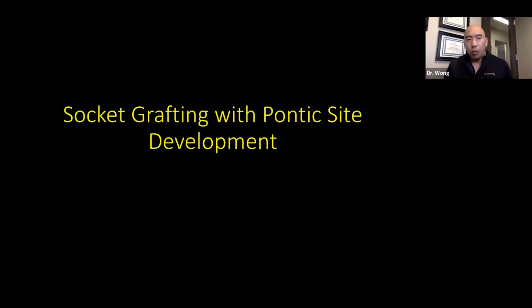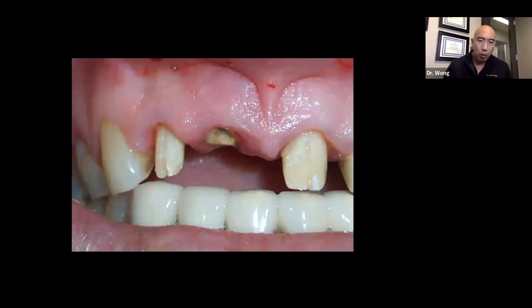I'm in Tulsa, Oklahoma. There's a lot of times where we just still do bridge work. So if we're doing bridge work, does that mean we don't graft the socket? The answer is no. We still graft the socket. And the reason we do that is so that we can develop the pontic site so it looks good. So how do we do that?